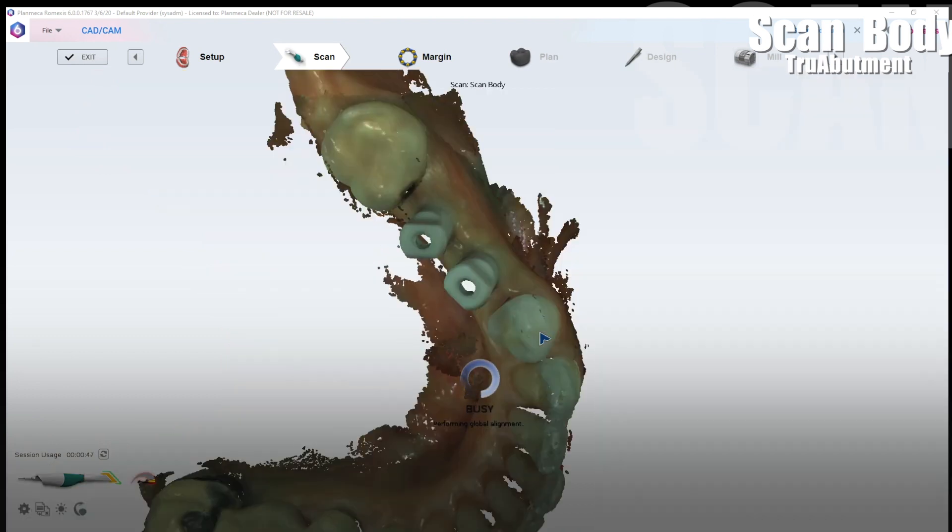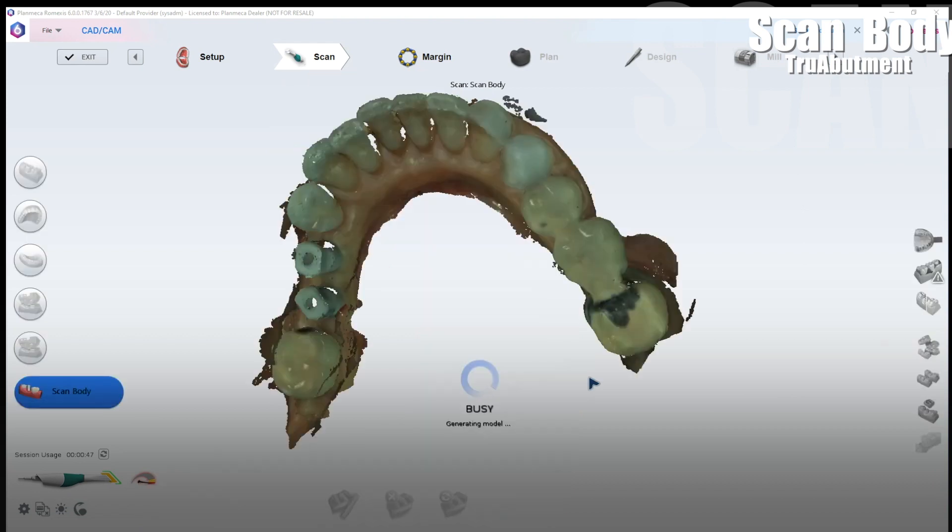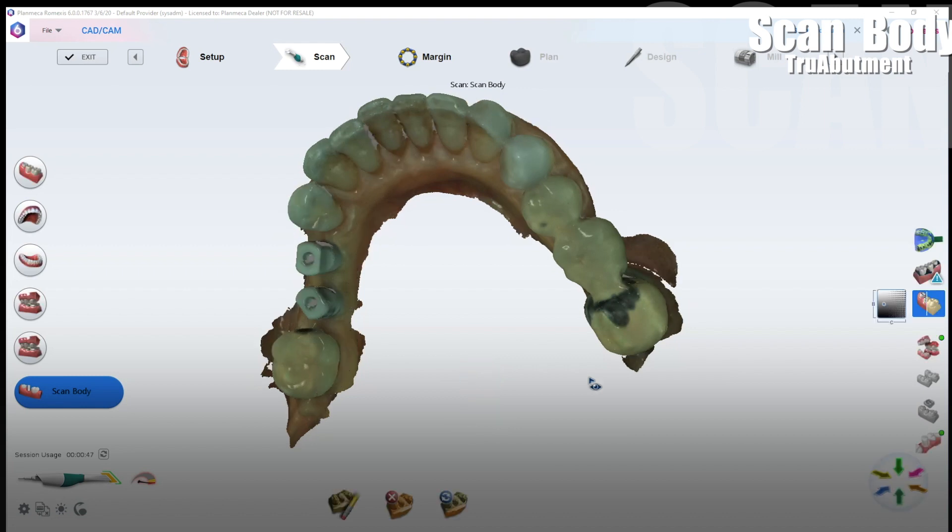So once again you have a few options and I'm gonna go through this slower in a minute so that we could talk about how you do the whole process. Let's take a look and see how this model looks and exactly how much data you need to get of the scan body for it to be a good impression.